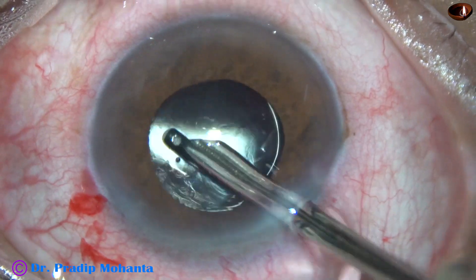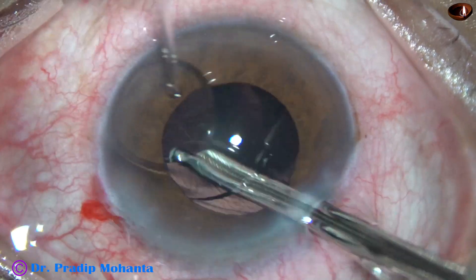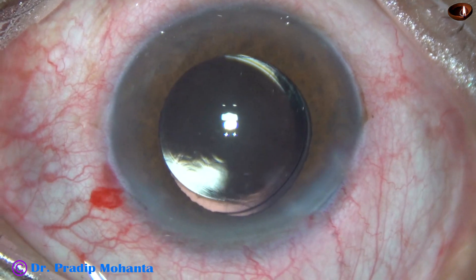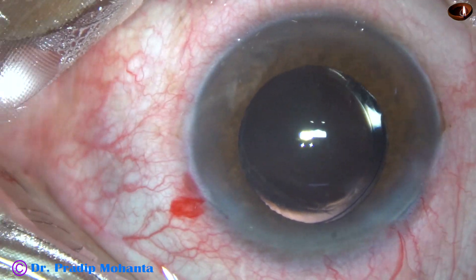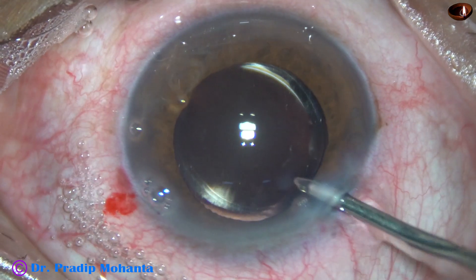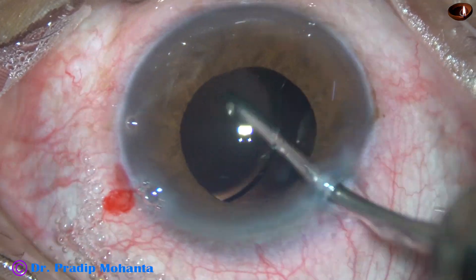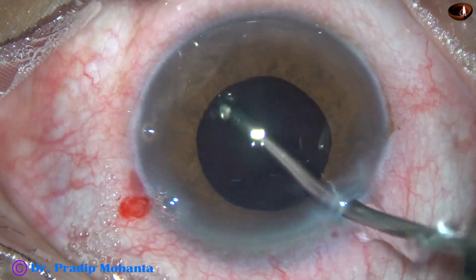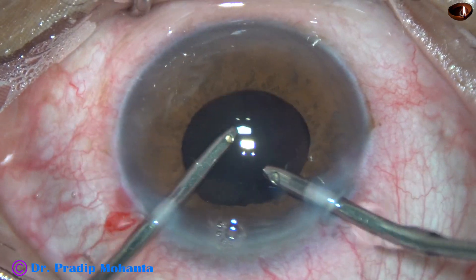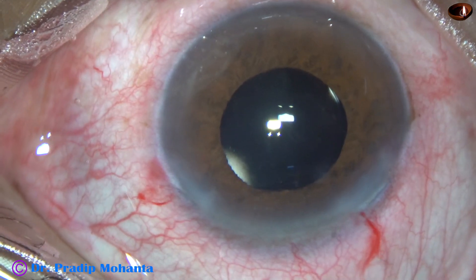I am irrigating at this moment, then I go behind the intraocular lens and irrigate the capsular bag. By irrigation alone, a lot of VISCO comes out. Now I am going to use the irrigating cannula of bimanual irrigation-aspiration, doing some more irrigation of the anterior chamber and then of the capsular bag. Now I use irrigation and aspiration together. Watch that I am lifting the anterior leaf of the main wound, thus keeping the anterior chamber well-formed.